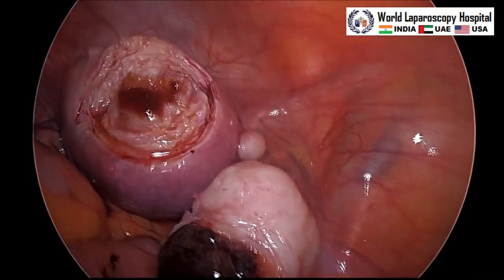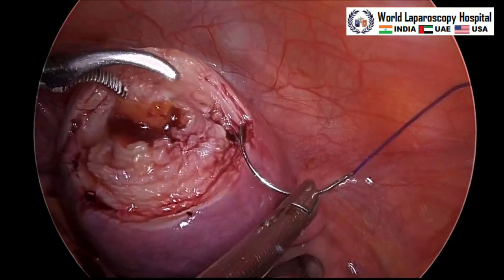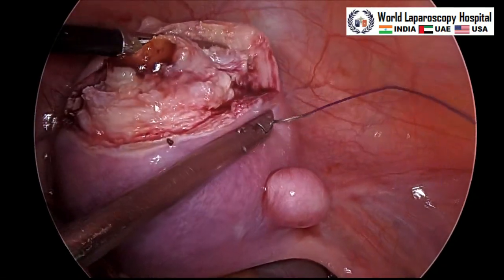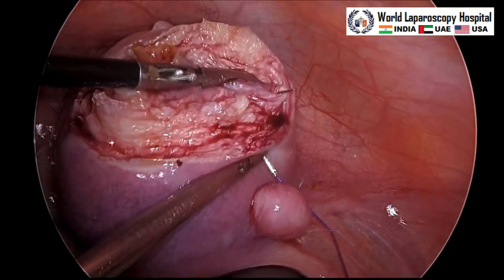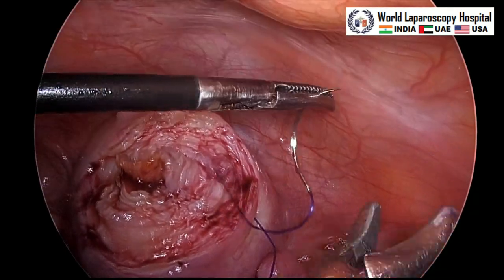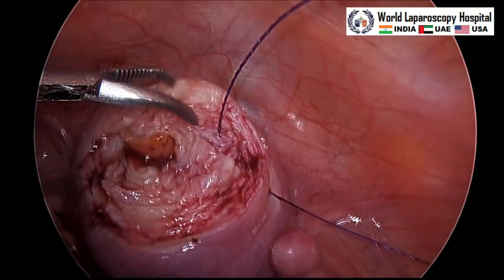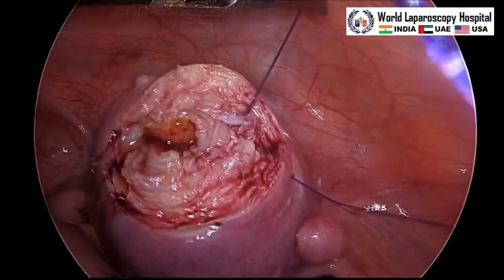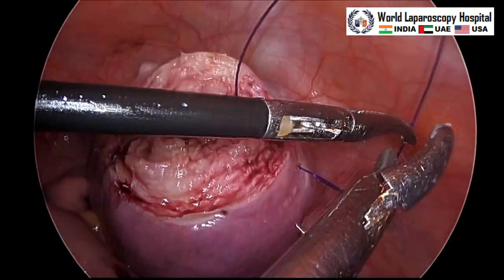So we can see here the part which you are seeing in color, that was in the cavity. And now we will start the suturing, and we will take muscle at the level of the basal layer, and in the first layer, the cavity wall should be approximated. We are using the V-Loc suture here. The suture should be introduced through the serosa. In V-Loc suture there is a starter loop. And once you introduce the needle through the loop, you will get a starter knot.